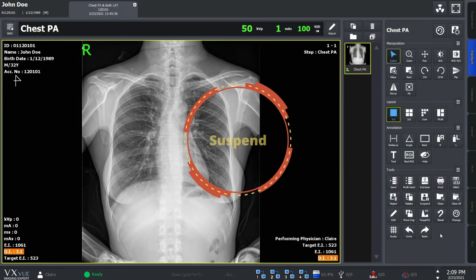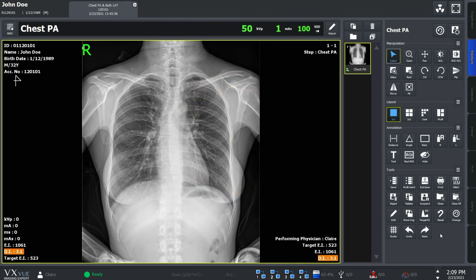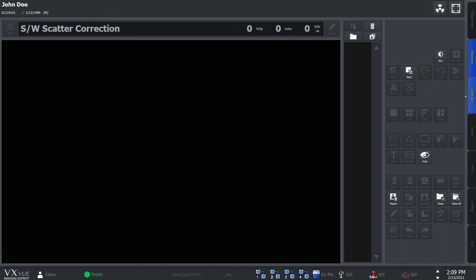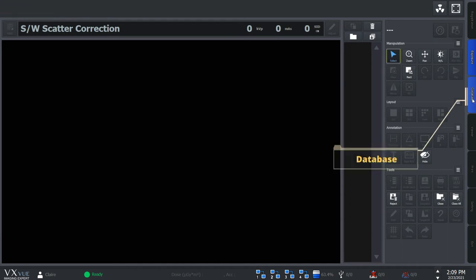You might need to suspend the study when there needs to be a time interval between extra exposures of the same patient, or you have to move to see a different patient before finishing working with your current patient. In any case where you need to halt the study and come back later, suspend is the option for you. Click on the suspend button and you can work on the study later by reopening it from the database mode.